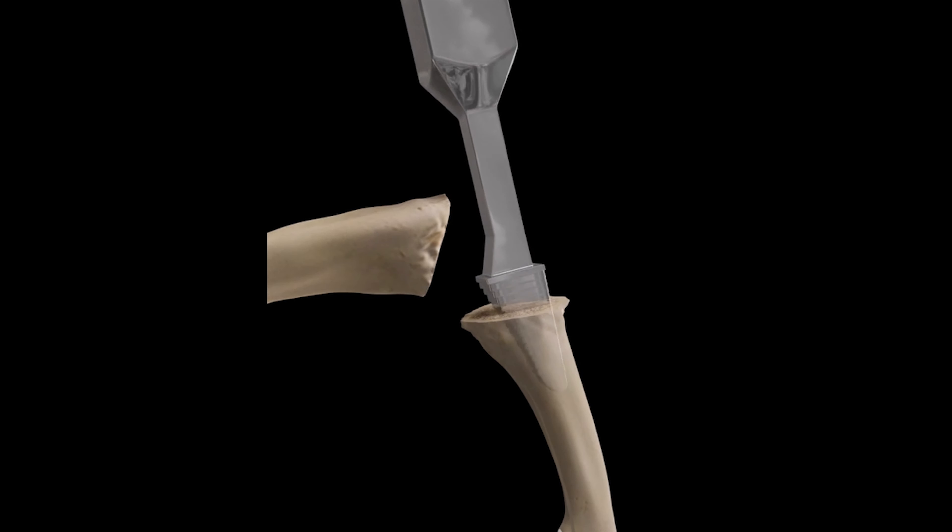The stems of the prosthesis are then impacted into the bone, which heals, securely fixing the prosthesis in place. The two prostheses articulate with each other to restore the finger's natural range of motion.